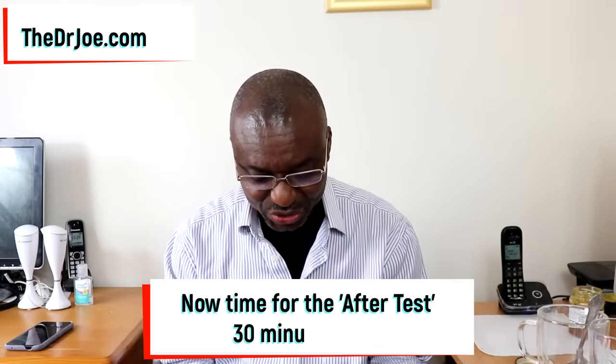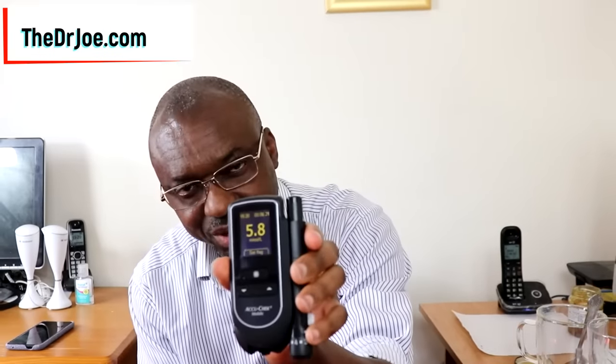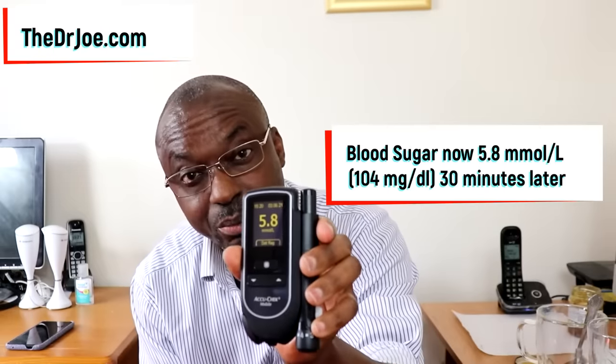So what we're going to do now is the after test. We turn on our machine. Next, prick myself again. Squeeze out some blood — we've got some blood here. Apply it to the blood sugar monitor. It has read. So what's the blood sugar now? There you go — unbelievable. 5.8 millimole per liter.